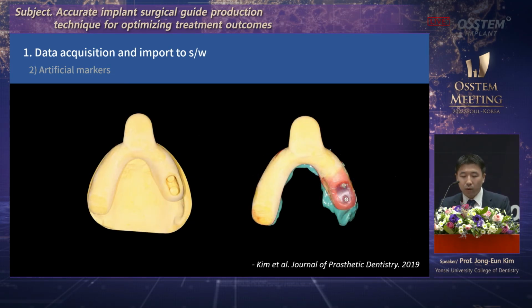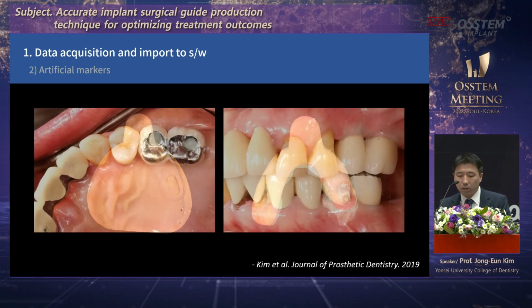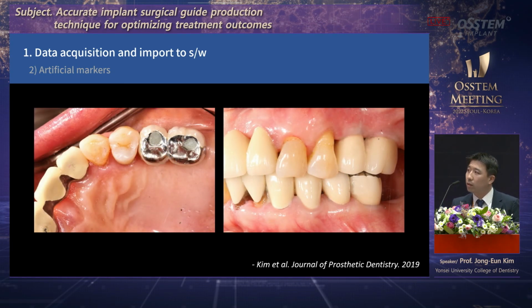The accuracy of surgical guide can be increased. I also use this for final prosthesis fabrication. You can do it more easily because it's quite convenient.